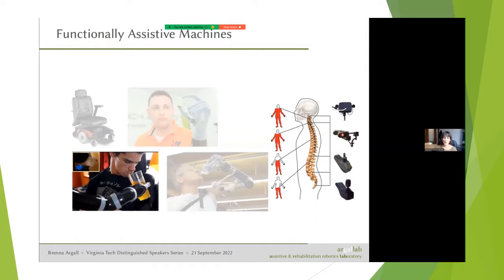So this is an arm that was designed to be mounted to a powered wheelchair. It's usually 6 dimensions in its assistive form. For its research form, you can get it in 7-dimension control as well. You can see the inset here. He's actually using his foot to operate this joystick.